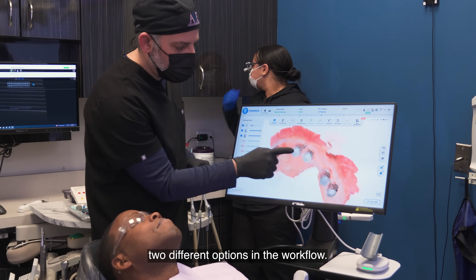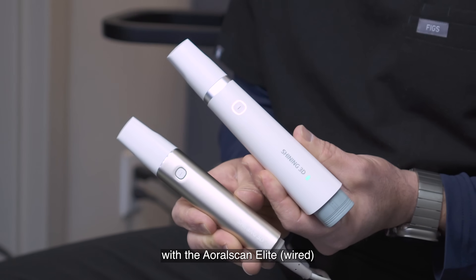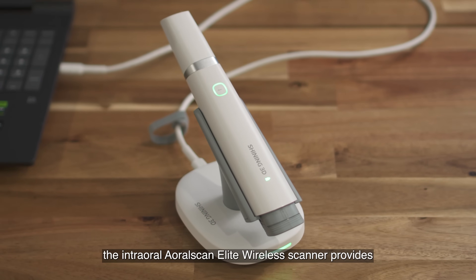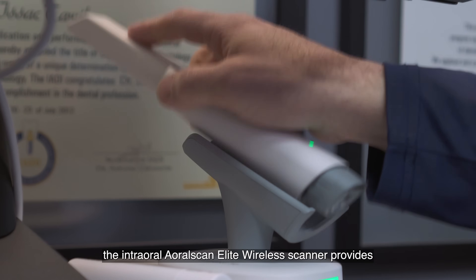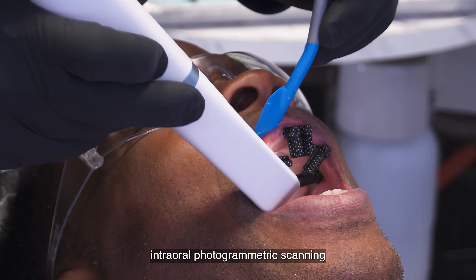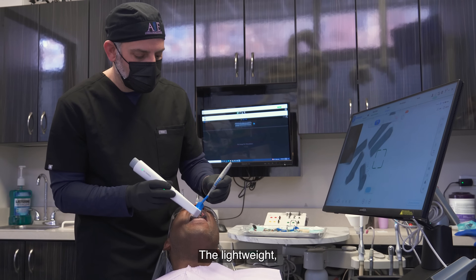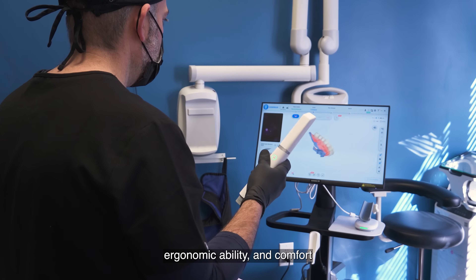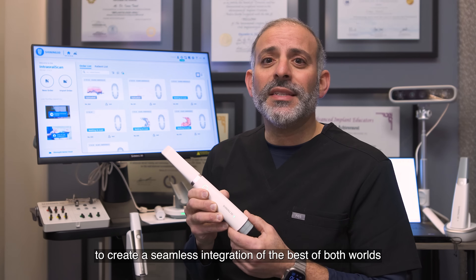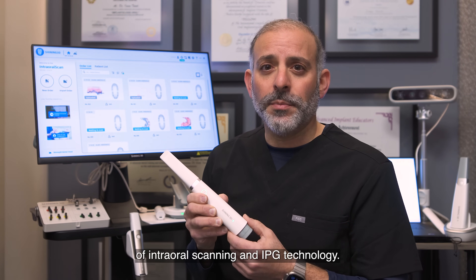So now we've provided you with two different options in the workflow. Building off our tremendous success with the Aoral Scan Elite wired, the Aoral Scan Elite Wireless scanner provides the same great benefit of intraoral scanning and intraoral photogrammetric scanning — without the wire. The lightweight, ergonomic ability, and comfort level has now been taken into the wireless realm to create a seamless integration of the best of both worlds of intraoral scanning and IPG technology.